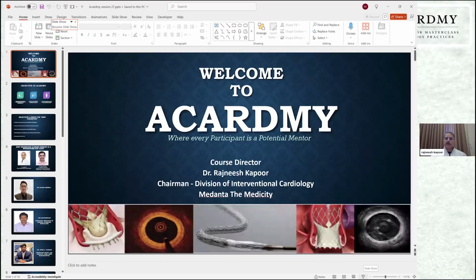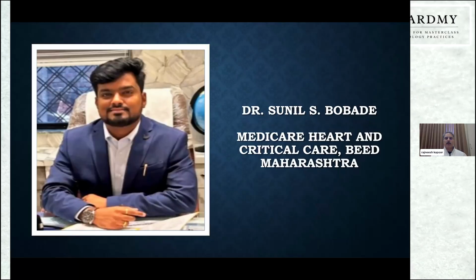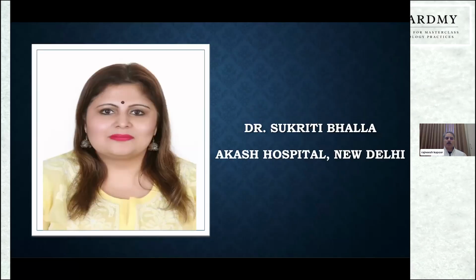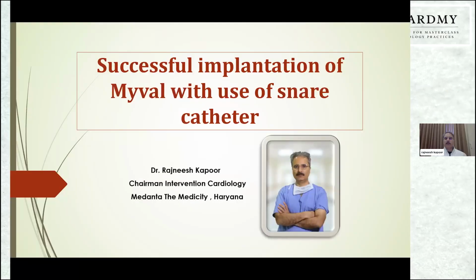Okay, so I always keep the small structural case in the end because I believe that we are entering into the era where structural cases are going to increase further, and that gives you an overview of how structural cases are being done. So this is another structural case which I've done last month or so.